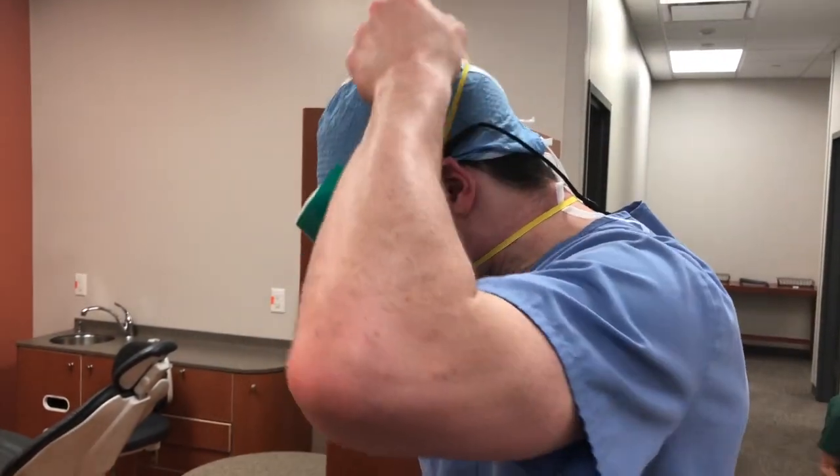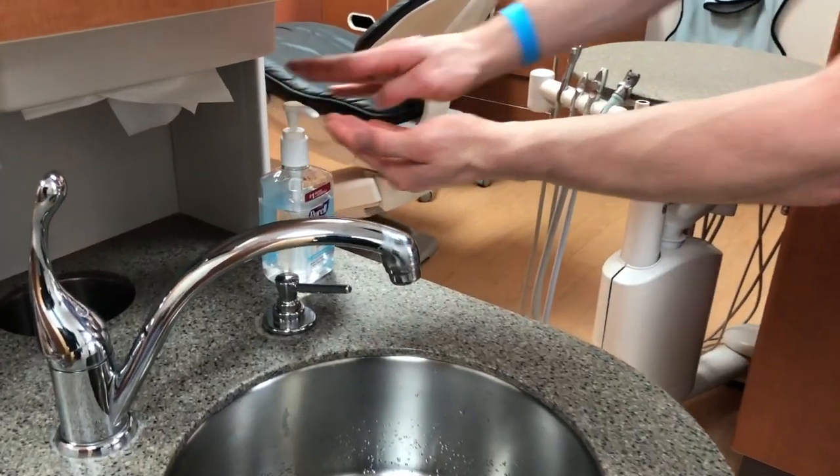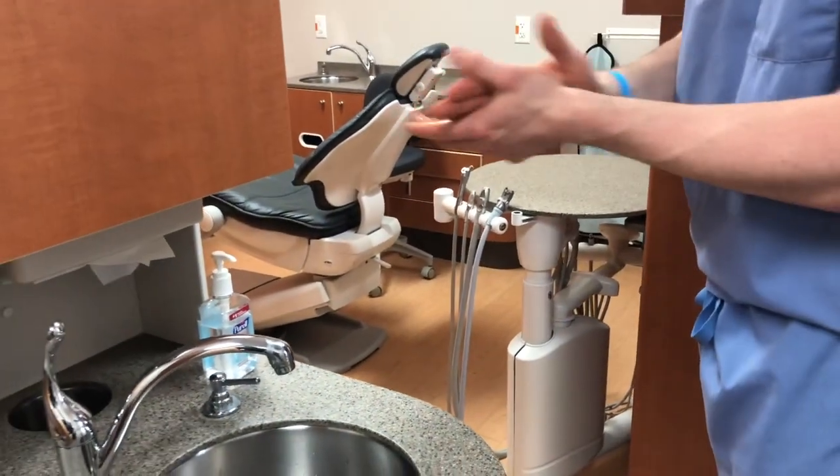Next, remove the face shield. Grasp the strap at the back of the head, pulling the face shield away from the face, and discard it. Perform hand hygiene.